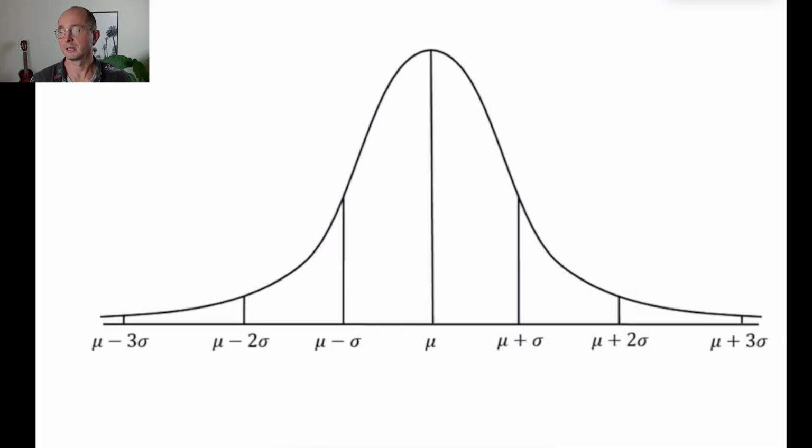An important question to ask at this point, and a lot of people ask me, is what is the difference between a T-score of say -4 and a T-score of -2? So imagine you have a line that shows you how many people are at each T-score.